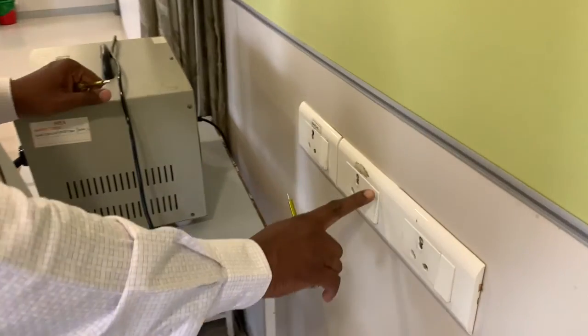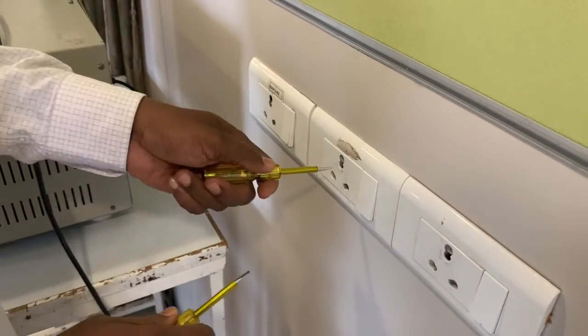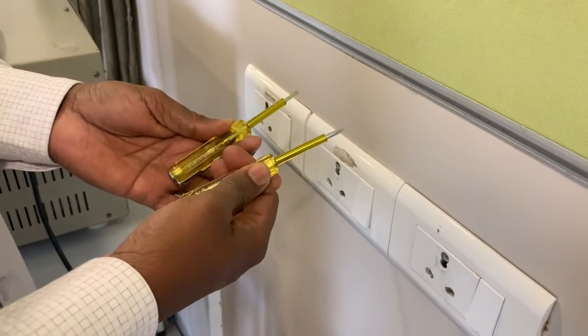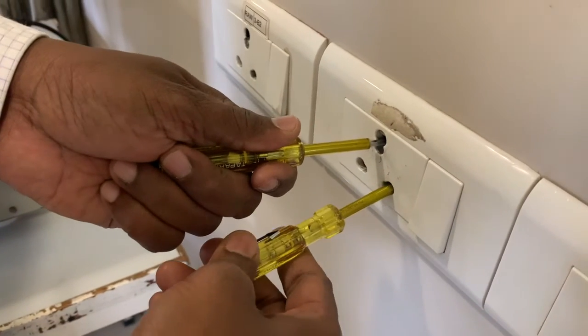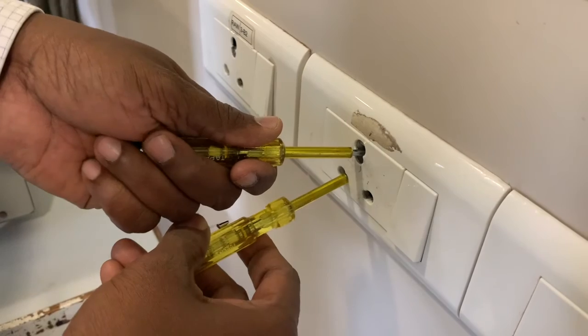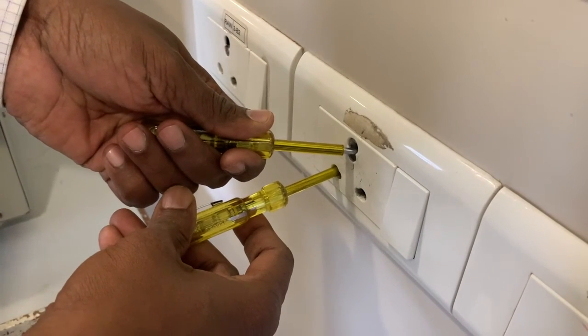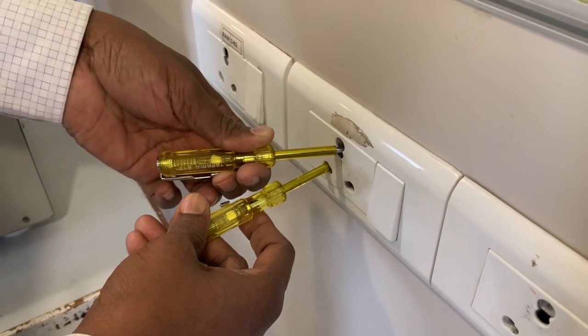First, when the switch is off, you are supposed to check it. This has a child lock, so you need 2 testers preferably. First you lift it and check the live wire. You see that there is no glow in the bulb. When you connect it to the neutral, also there is no glow, and when you connect it to the earth, there is no glow.